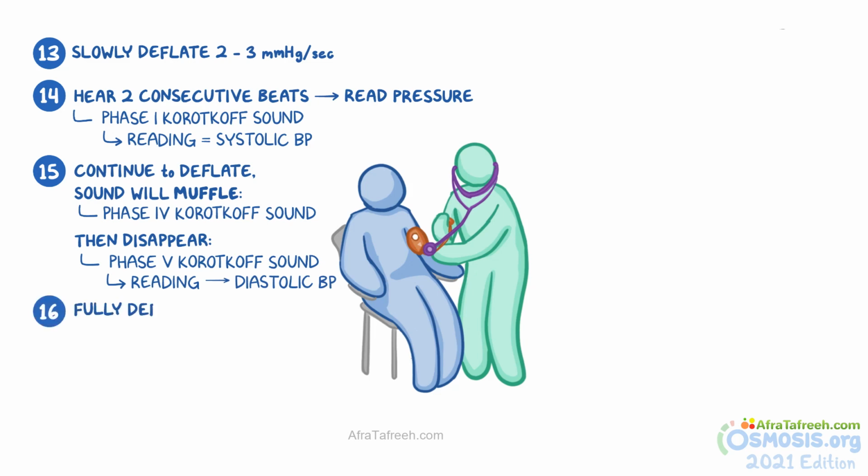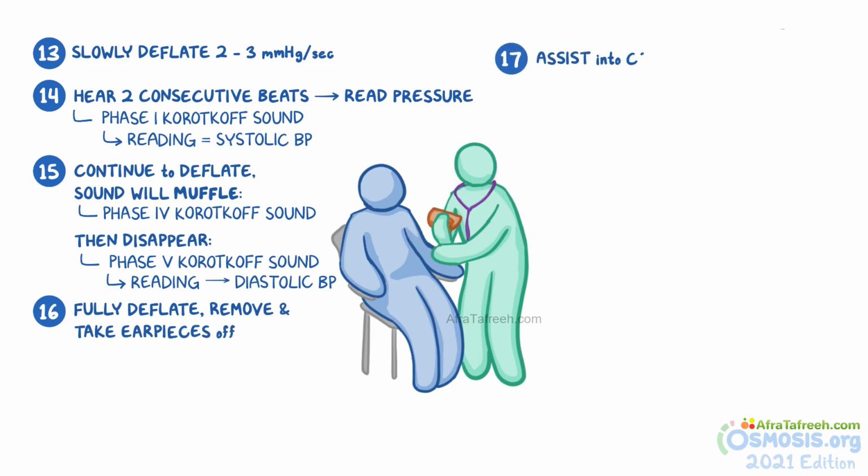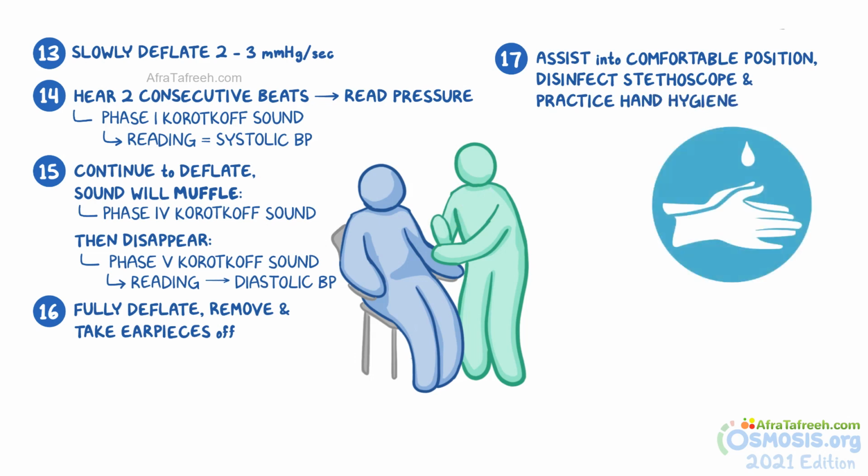You can then fully deflate the cuff, remove it from the client's arm, and take the earpieces of the stethoscope off. Finally, assist the client into a comfortable position, disinfect the stethoscope with the alcohol wipes, and practice hand hygiene.